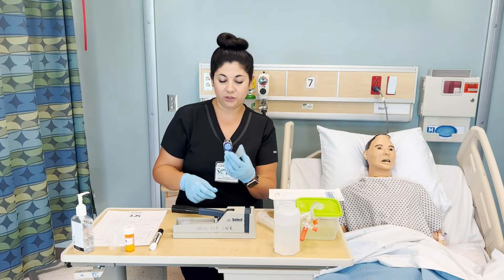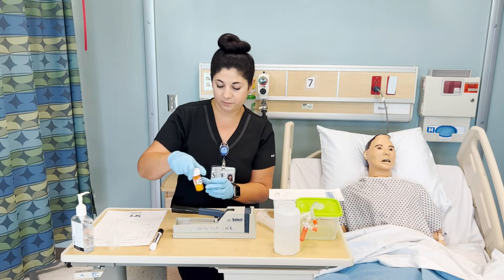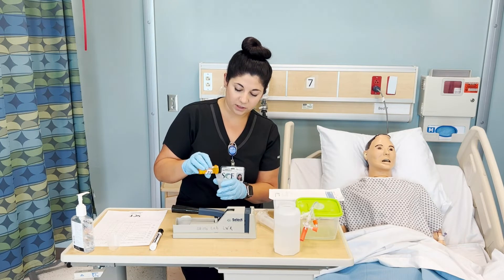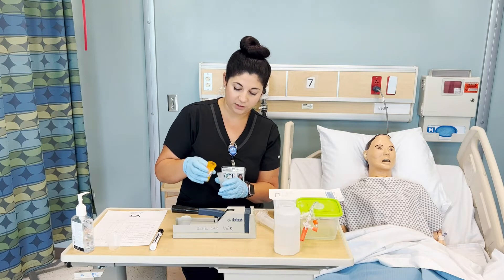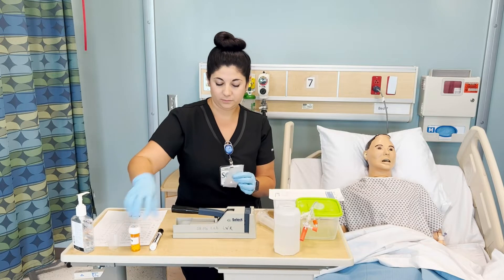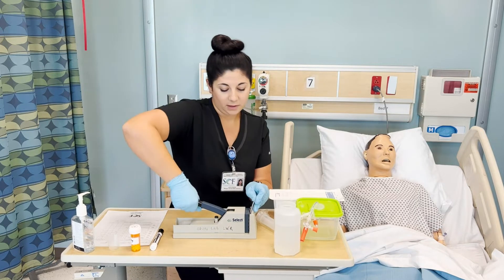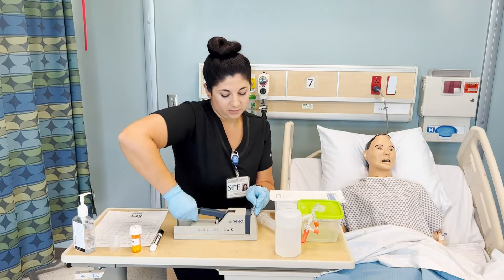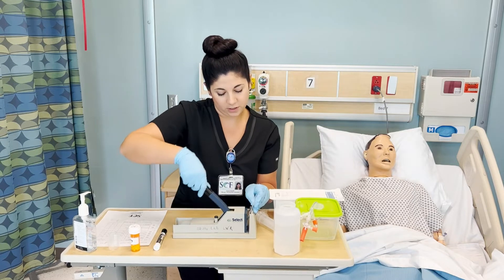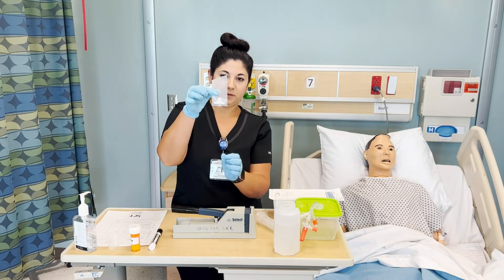For each medication, you should crush them separately, so you'll have one of these plastic pouches. Go ahead and drop the medication that you need in there. You lift it up and then push down. Do this a few times, moving it around so you make sure that it is fully crushed. Looks pretty good there.